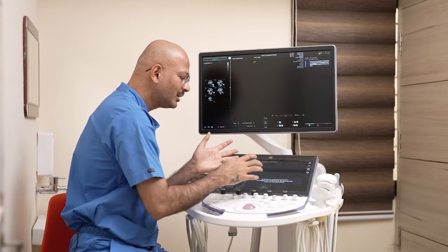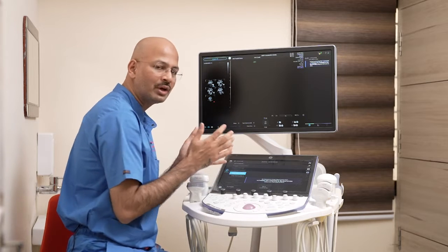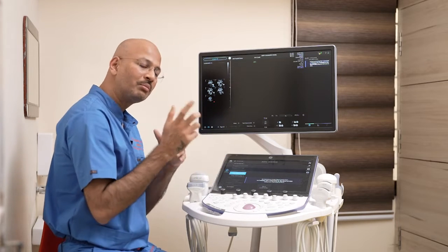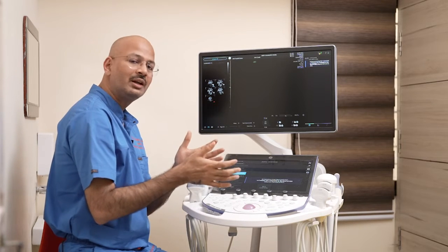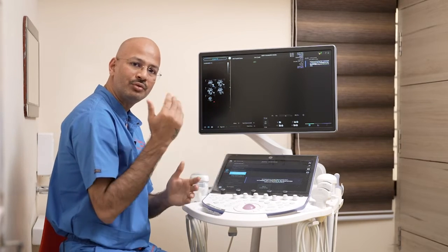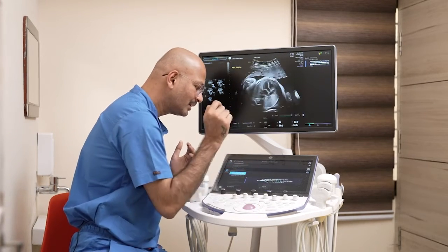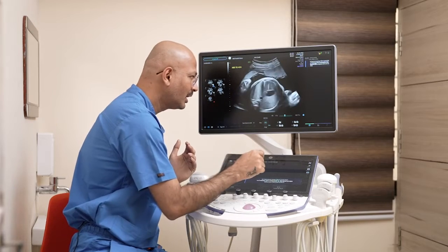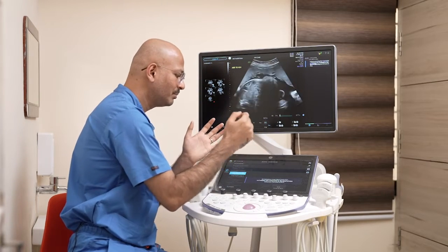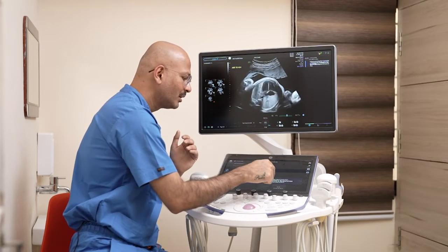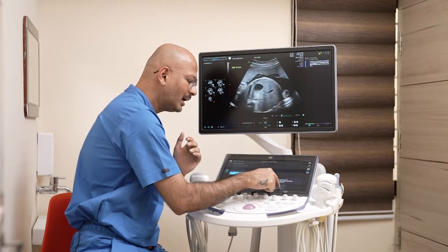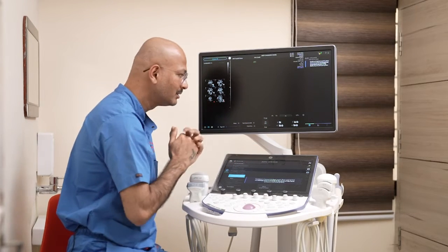Now it is asking to take a swipe from the fetal abdomen to the four chamber. I'm starting that. I've taken the swipe and I'm ending it.